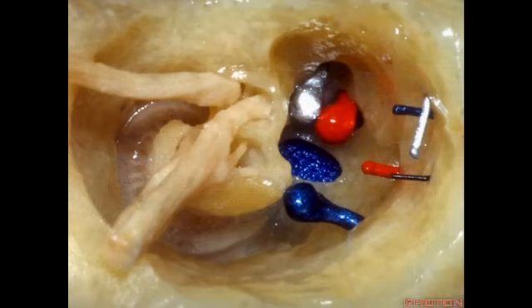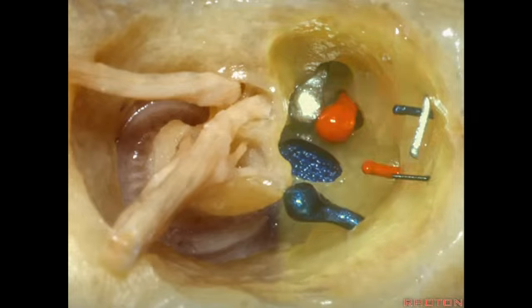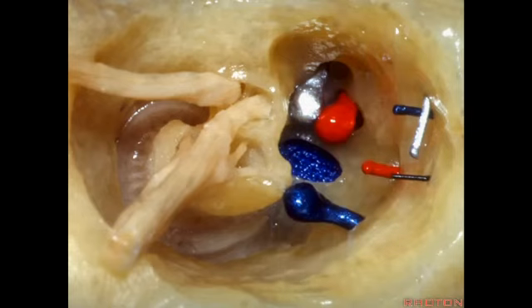So here we've drilled out the labyrinth, and the vestibule opens below the fundus into the cochlea, and this is going to be facial, Bill's bar, superior vestibular, the inferior vestibular, and this is the singular branch of the inferior vestibular that innervates the ampulla of the posterior canal.